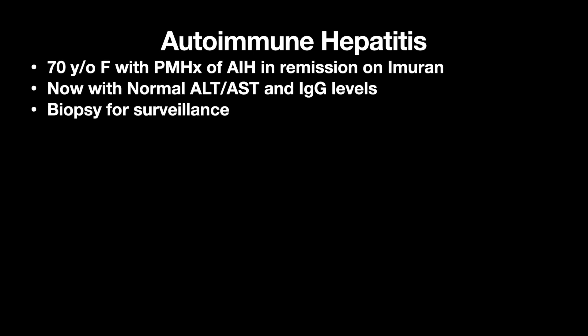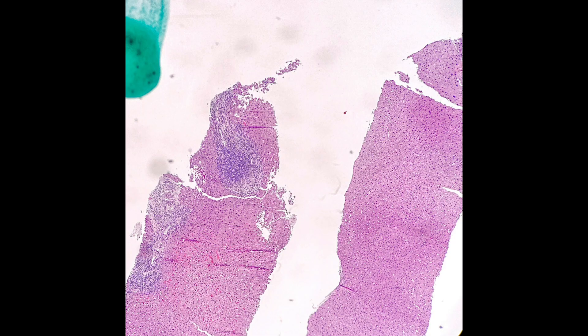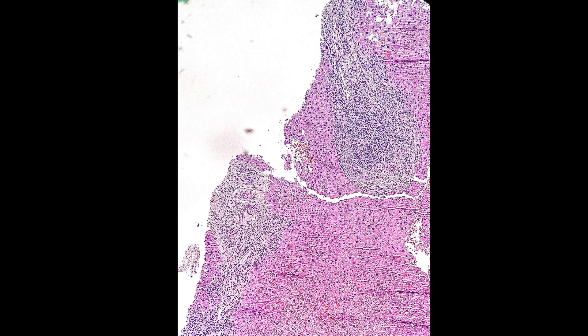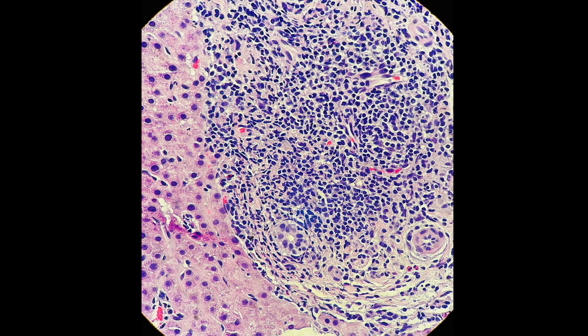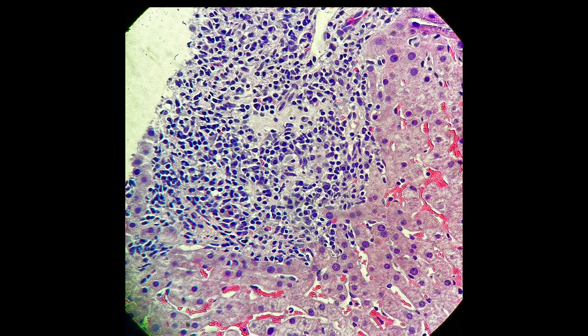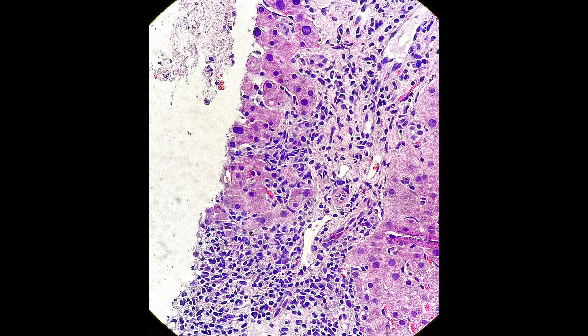This patient is 70 years old with a history of established autoimmune hepatitis in remission on Imuran, now with normal ALT, AST, and IgG levels, biopsied for surveillance. We can see inflammation in zone 1 portal tracks. Looking closer, we see plasma cells and lymphocytes — generally a lymphoplasmacytic inflammation. The bile ducts have some lymphocytes, but they're not the primary targets. A soft sign for AIH is that plasma cells tend to go to the edge of the portal track. Here is an instance where inflammation extends beyond the portal track into the hepatocytes — this is interface hepatitis.